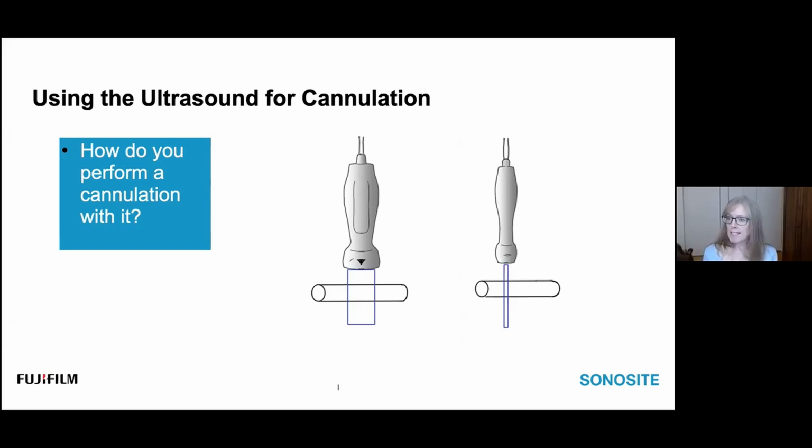So let's get right into the nitty-gritty then, because the slide says we should. Using the ultrasound for cannulation, how do you perform a cannulation using the ultrasound? Okay, that's a loaded question. I've got here on the right of this particular slide deck a couple of images about how to hold the probe, orientation of the probe.